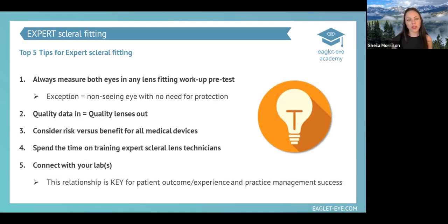I have a few tips. There are so many wonderful things that we can learn from each other. And that's why I'm looking forward so much to having the opportunity to get back in person, where we can sit at the bar after these conferences, talk about scleral lenses and learn tips and tricks from each other. Here's a top 5 off the top of my head, just to share with you things that really have been helpful in clinical practice in our office.